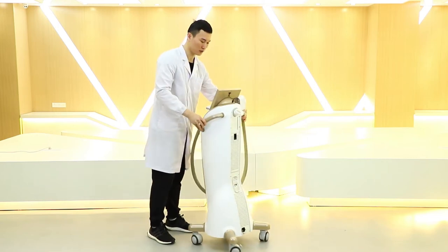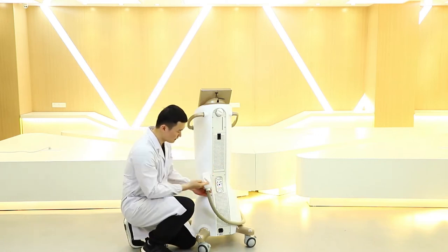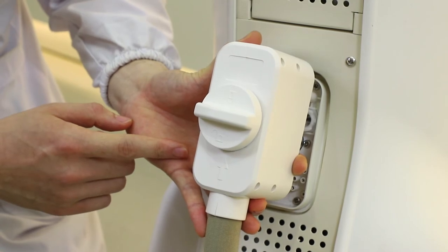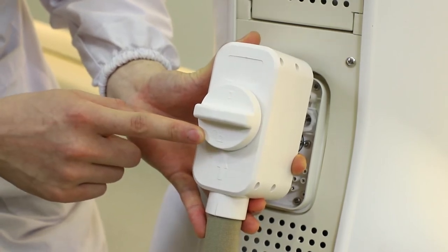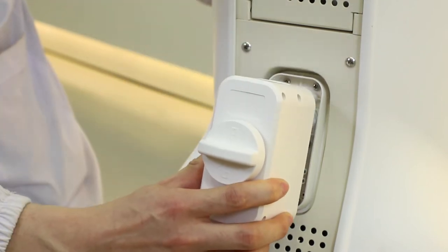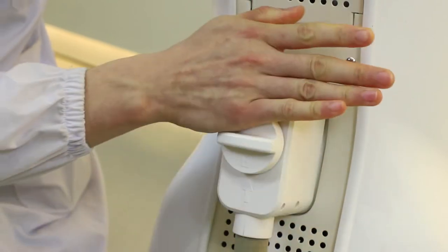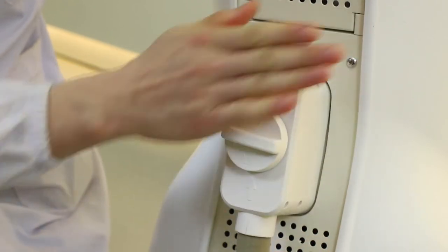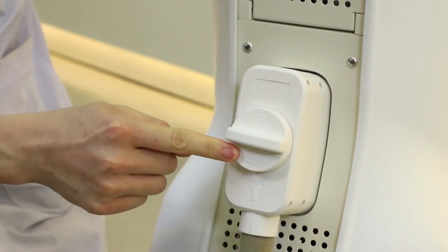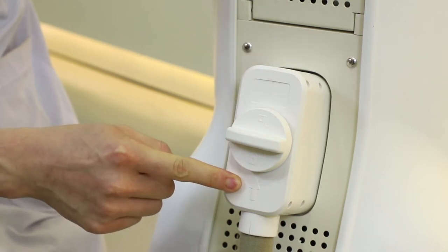The next step is to install the lid to the back side of the machine. Before installation, the most important thing is we need to turn the unlock mark to the arrow so we can connect the handle to the machine. Press like this, and then spin this part so the lock mark is aligned to the arrow. The installation of the handpiece is done.